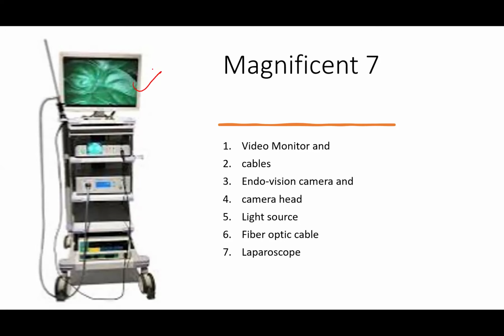So the video monitor and the cables, the endo vision camera and the camera head, we will discuss this shortly. Then you have the light source and the fiber optic cable that is connected to the light source. Then the laparoscope itself.